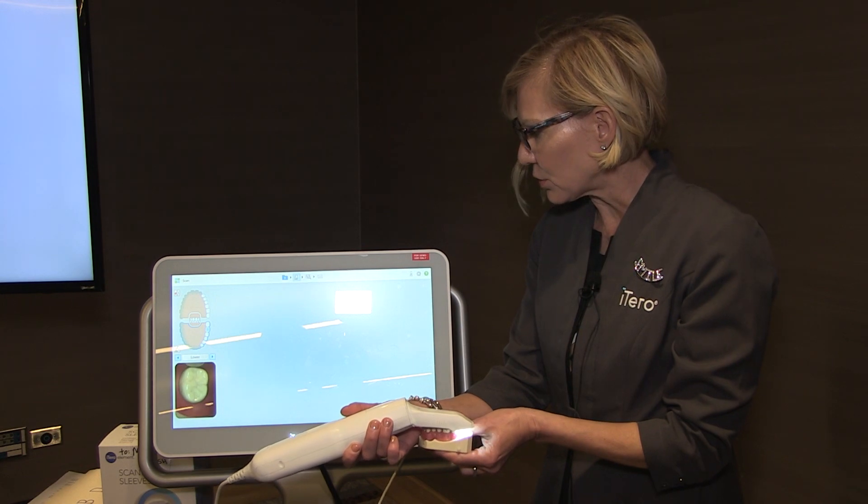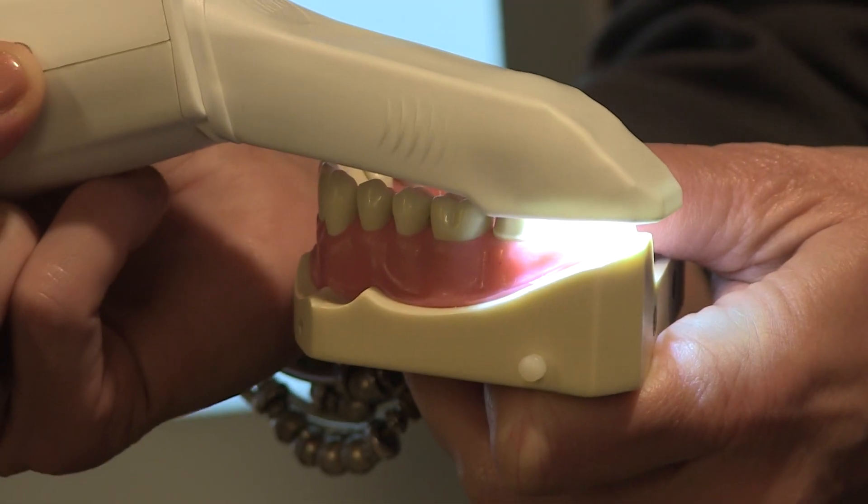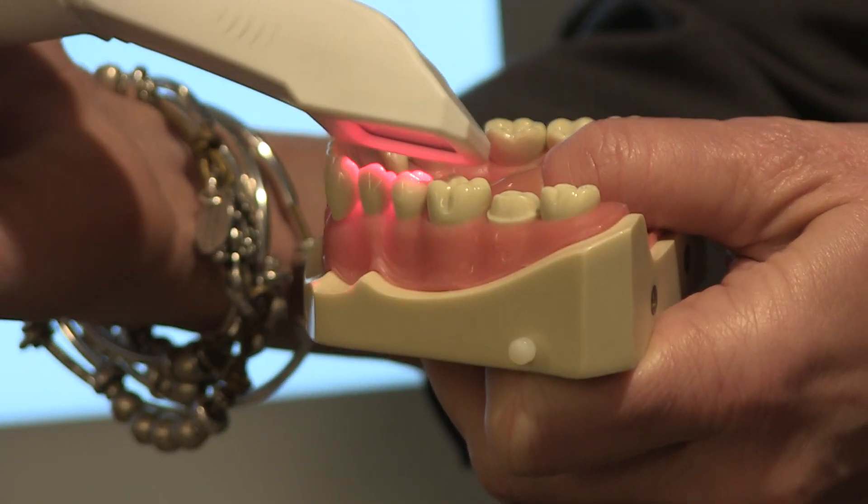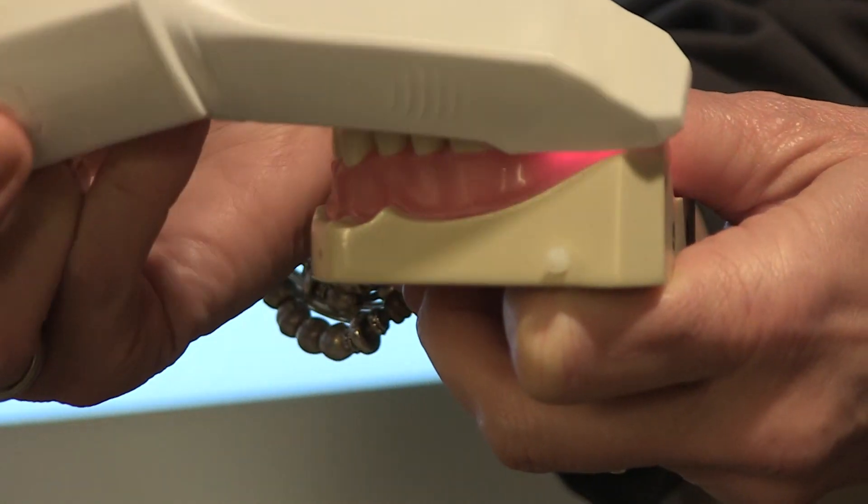I'm going to start on the occlusal. Touching the tooth surface, I'm going to scan the occlusal, the lingual, and the buccal.